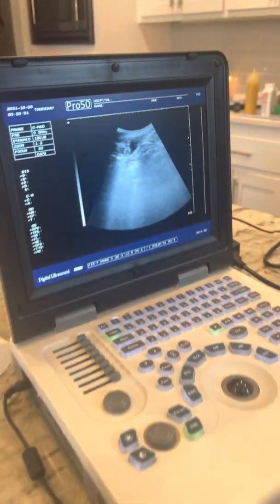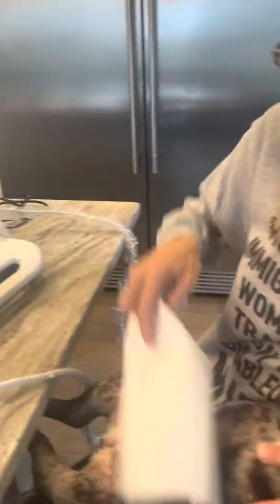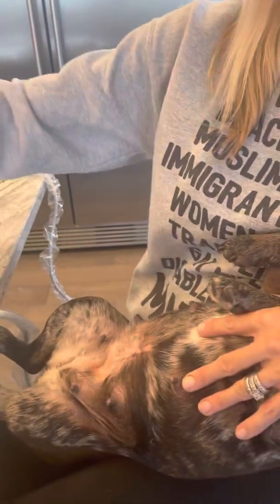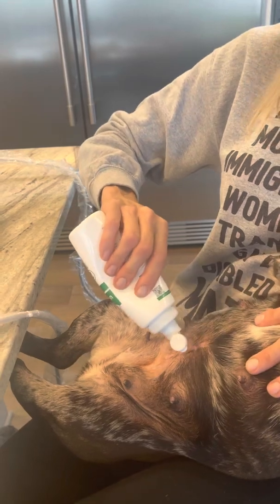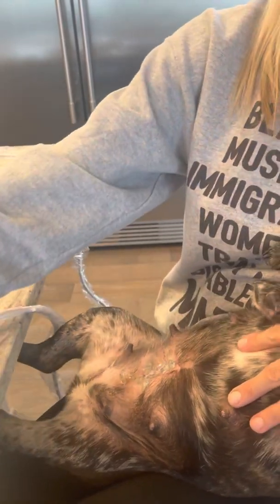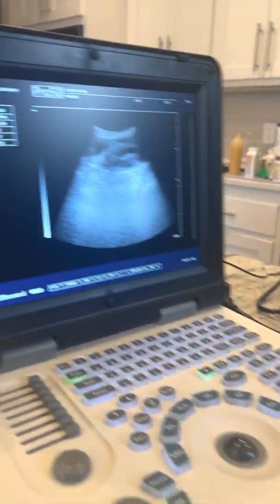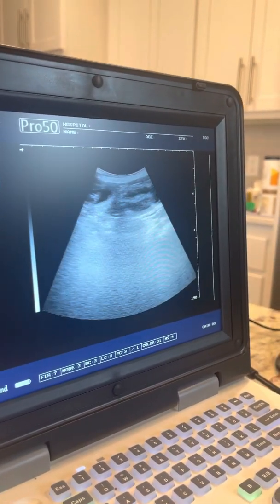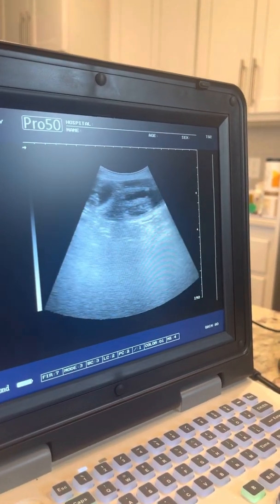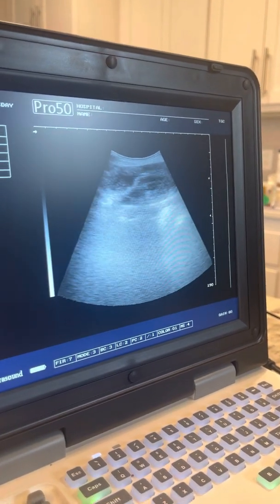This machine also has the capability to zoom, to freeze, all that good stuff. So that is the image with the alcohol — now I'm going to show you with the ultrasound gel. The gel allows it to slide a little bit easier, and you can see we can still see this image. It's a little less crisp, but nevertheless a really great tool to move this wand around.